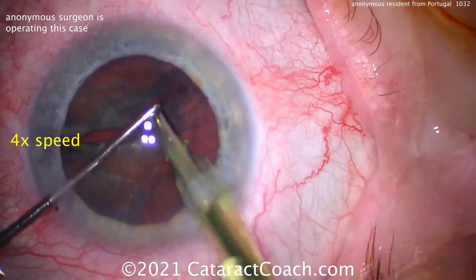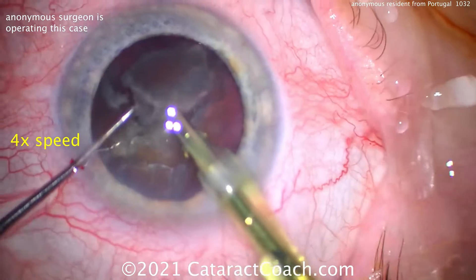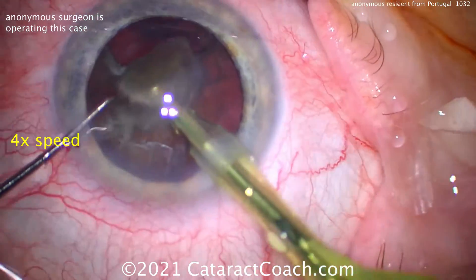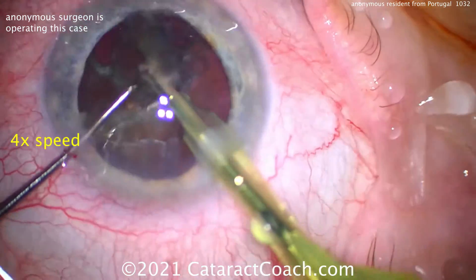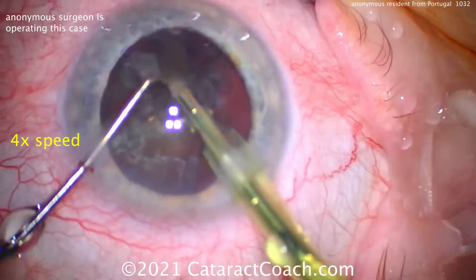Remember: if you're holding the nucleus with FACO power, you have a finite window of time — about a second, maybe two — to hold that nucleus while you chop it. So that was a nice sub-chop to make a quadrant, and that quadrant can be removed. Very nice.